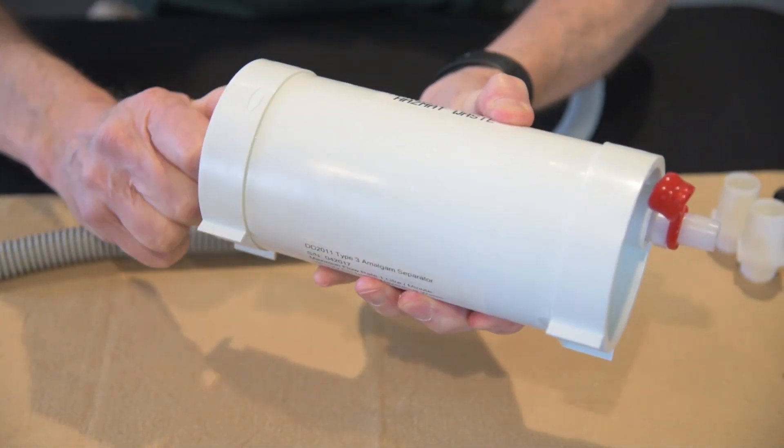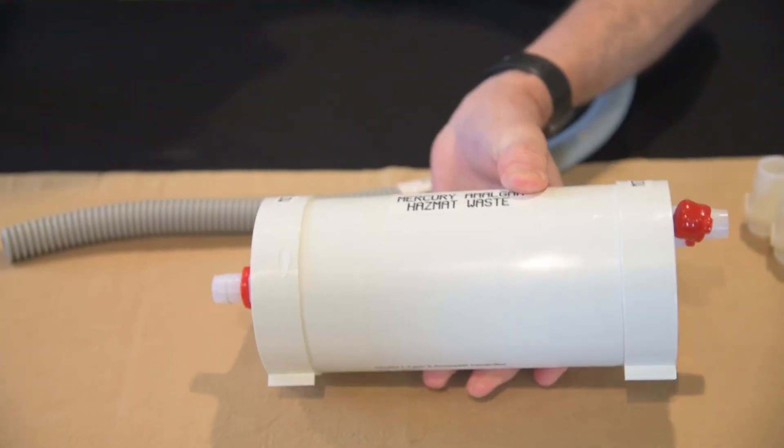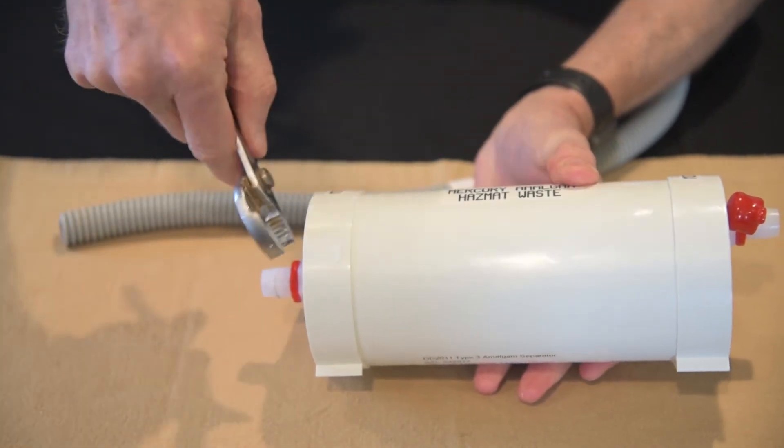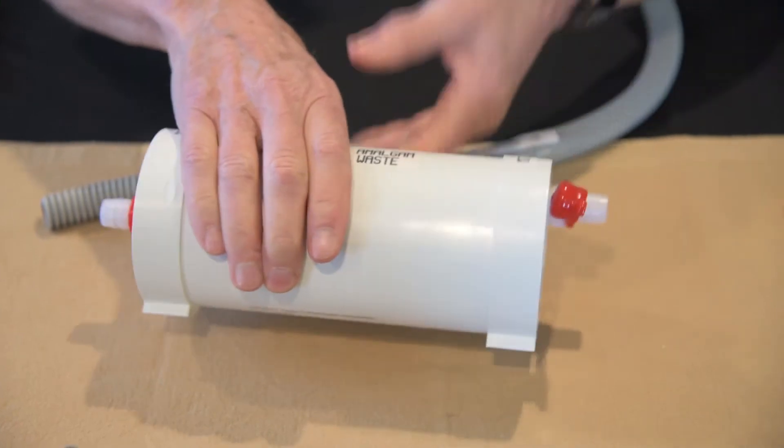You take a wrench and just snug those up a little bit. Nothing will come leaking out of this. This is a vacuum system. If anything, air would be leaking into it, not anything coming out.